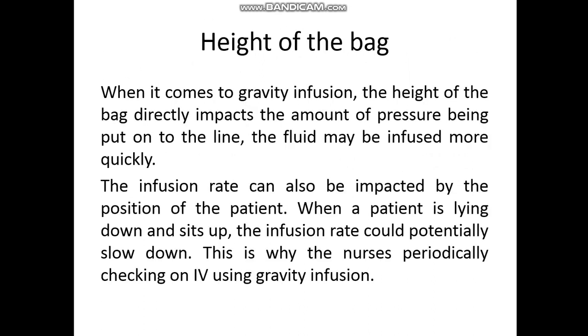Then height of the bag. How can we adjust the height of the bag for proper infusion? When it comes to gravity infusion, the height of the bag directly impacts the amount of pressure being put on the line. The fluid may be infused more quickly.